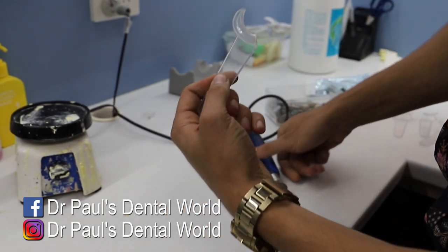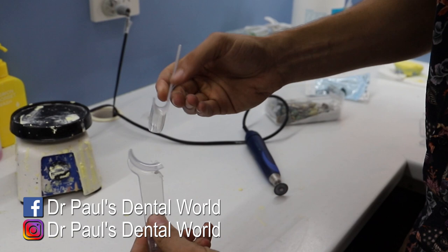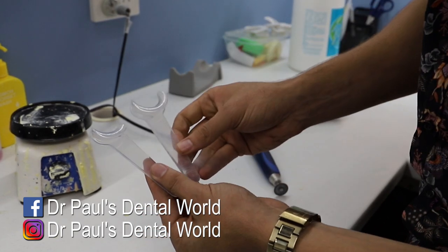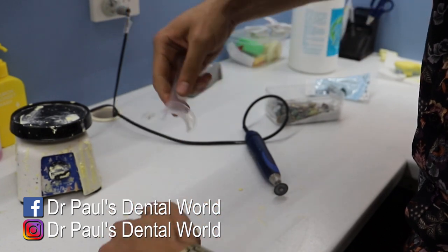So that'll give us something like this. Now for the other one, make sure that you do the other side, otherwise you'll end up with two of the exact same. So for this one, we're going to make sure that we take off the bottom bit.